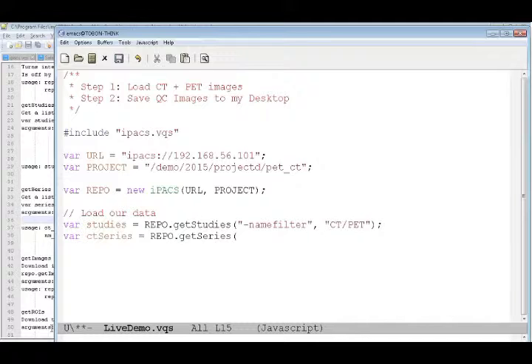So these functions all return JavaScript arrays. They have a list of studies stored as a JavaScript array, and you can index into them with these brackets. One thing to remember, if you're a MATLAB programmer, everything's indexed from 0. MATLAB tends to be the exception. So you start at 0, 1, 2, 3, and so on. So studies of 0, I'm going to get the modality of CT.